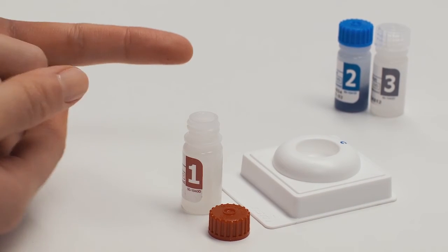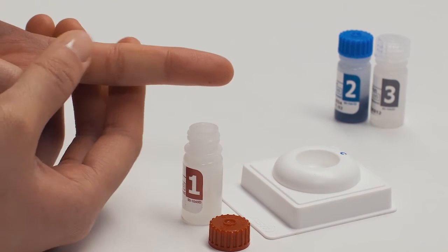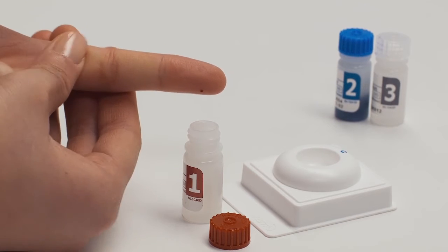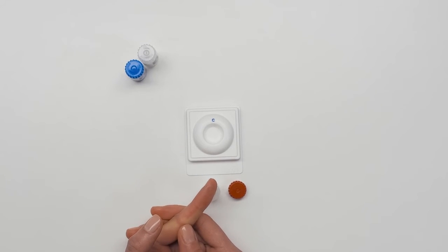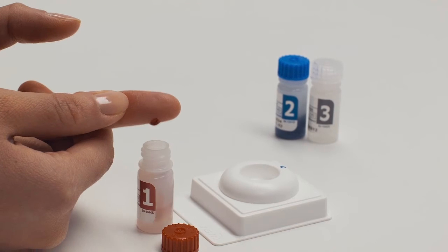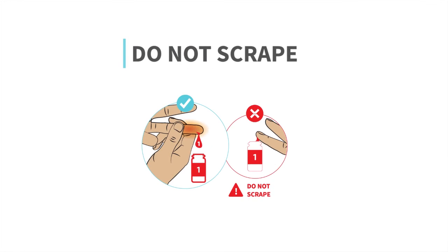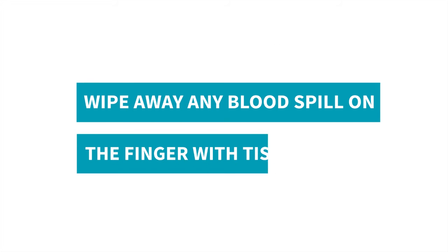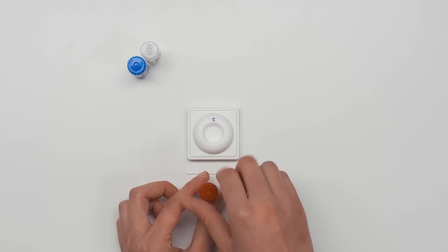Rub the finger to get a larger, round drop of blood. Let one drop fall into bottle 1. Do not scrape your finger on the bottle. Twist on cap of bottle 1. Apply a bandage.